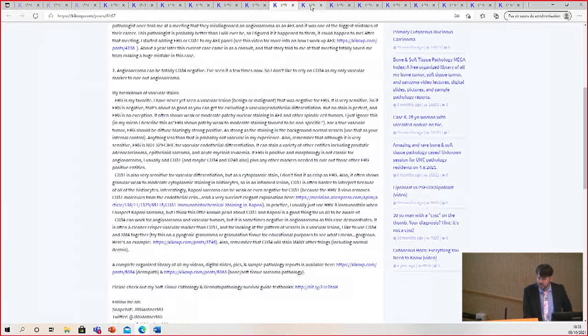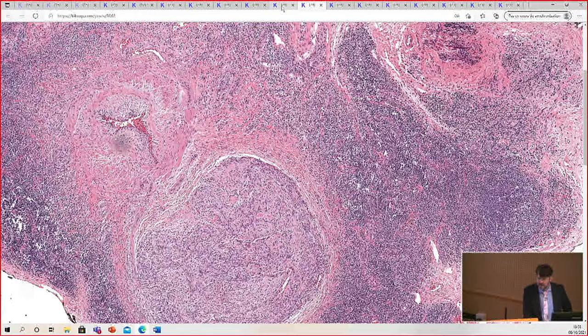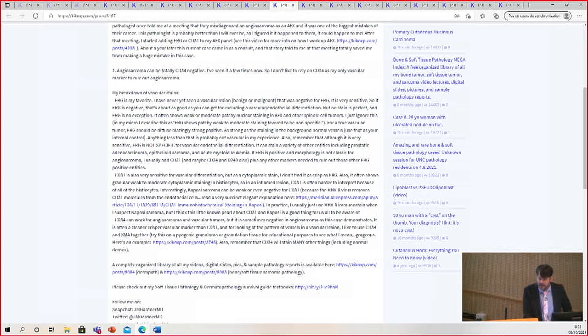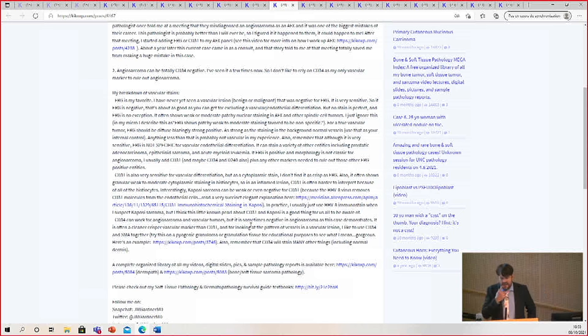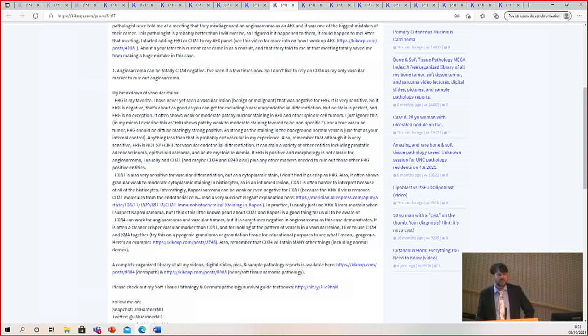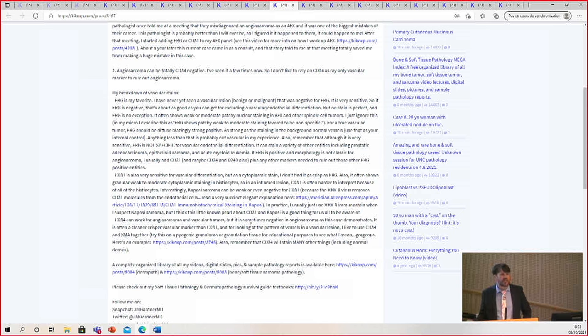So CD31 is good, but it will be a little harder to read sometimes. Also, Kaposi sarcoma, to my surprise, sometimes is CD31-negative.